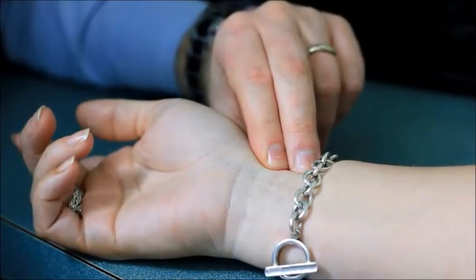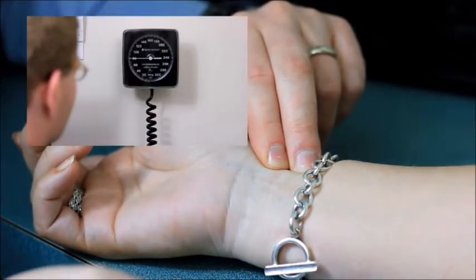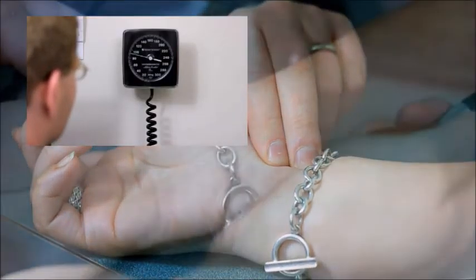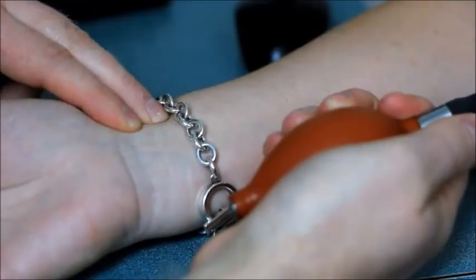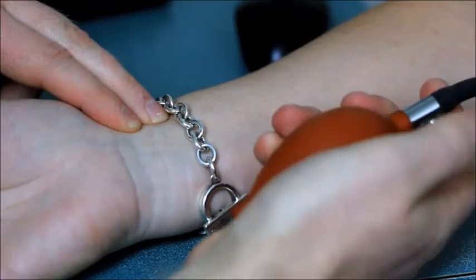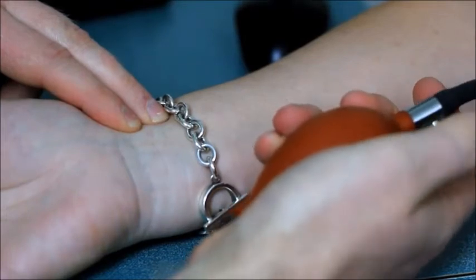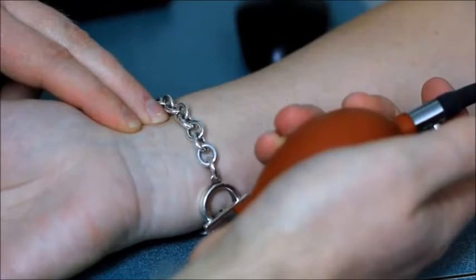Rapidly inflate the cuff to 80 millimeters of mercury while palpating the radial artery pulse. Continue to inflate in 10 millimeter of mercury increments until the pulse disappears. Then deflate the cuff at a rate of 2 millimeters of mercury per second, noting the pulse obliteration pressure where the pulse reappears.